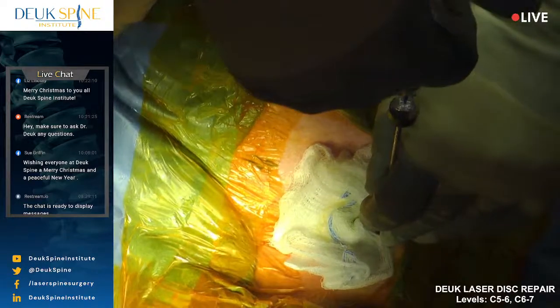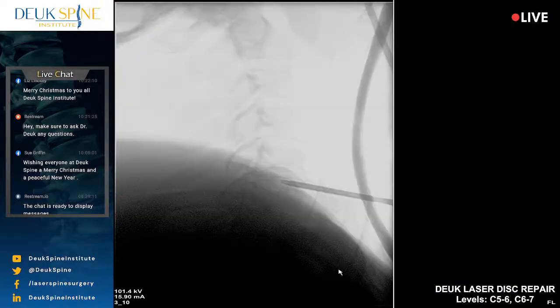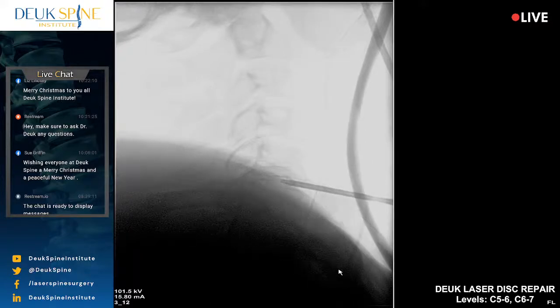I felt some going in. There it is. All right, we got it that time. Nice. Everybody relax. Take that. All right. This time the dye went in very nicely. We're going to advance. No, we need to advance this dilator to the back of the disc where the tear is that we're here to fix.